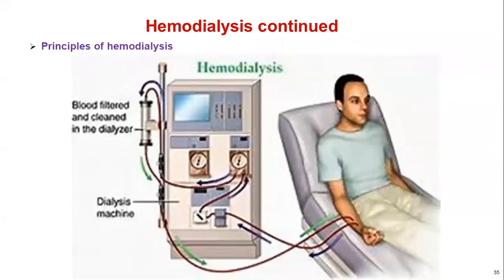Here, when blood or fluid goes through this machine, the machine will run 4 hours, because in every setting the patient has to continue 4 hours each session.